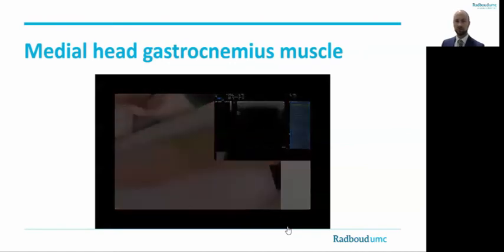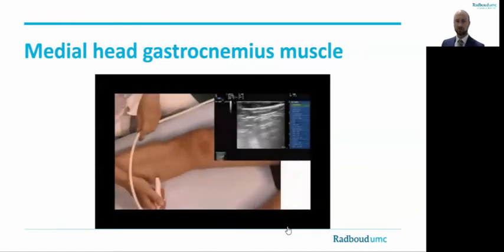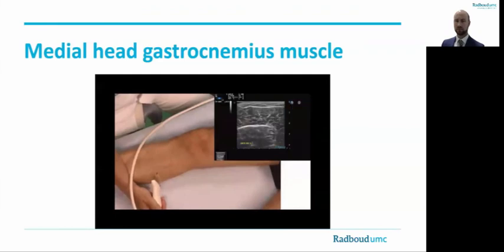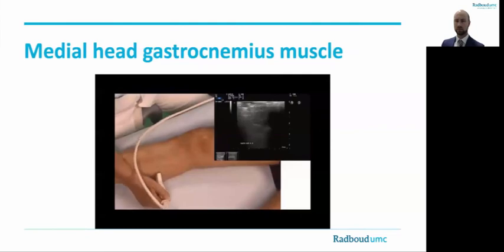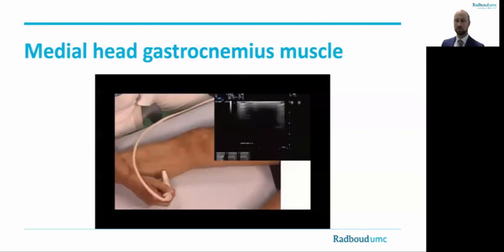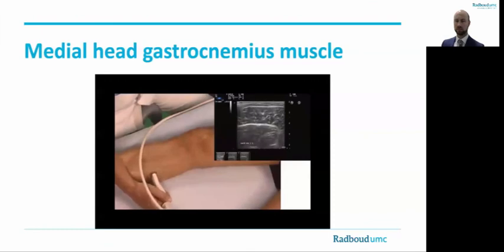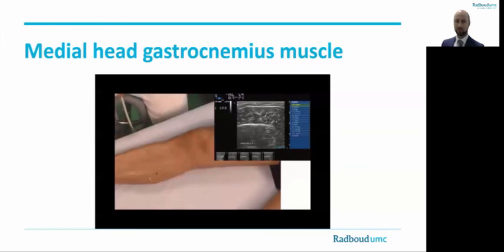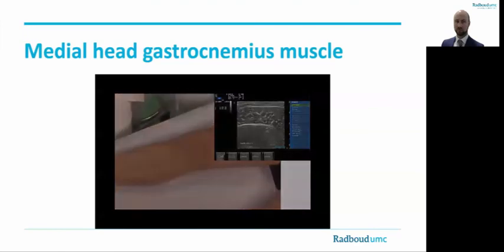The transducer is placed over the muscle in a transverse direction, with the left side of the probe aligned to the left side of the ultrasound screen. Please make sure that the probe has a strict 90-degree angle to the underlying bone or fascia. You can gauge this by assessing the overall muscle image brightness — the optimal image is where the underlying surface is most bright. The image is then frozen and the corresponding annotation is added, saved, and stored for further offline analysis. The probe is taken off and repositioned two times for three independent images. The third image is used for muscle thickness measurement using electronic diameter calipers. After placing the calipers the image is stored again. You have now captured the ultrasound image of the medial head of the gastrocnemius muscle for offline visual grading and quantitative grayscale assessment.